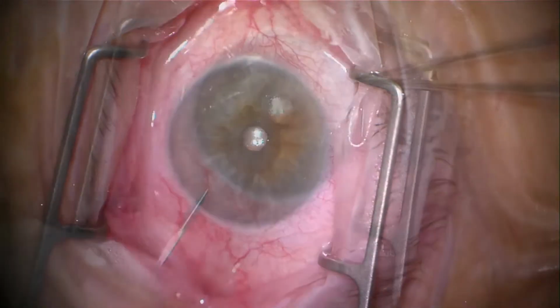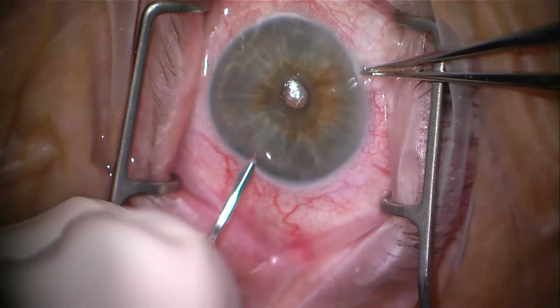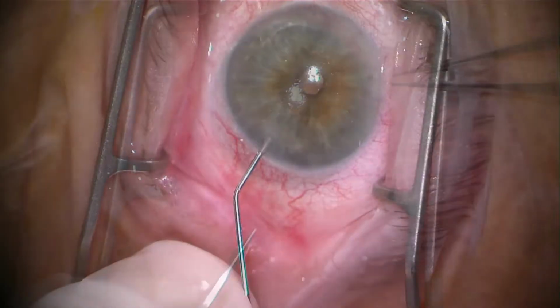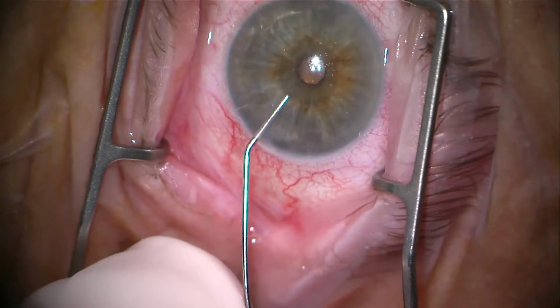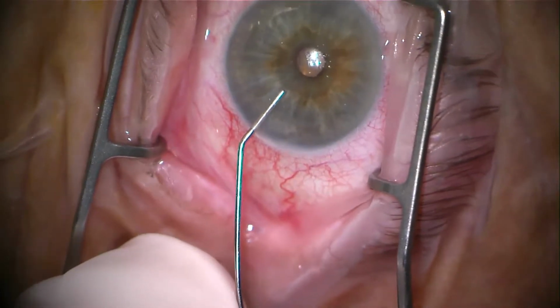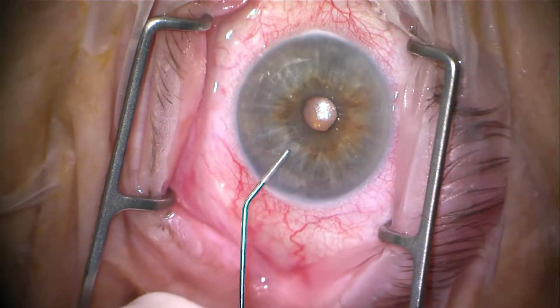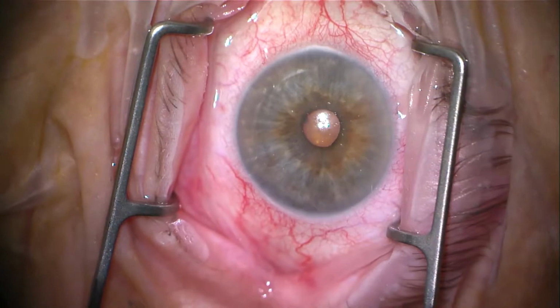All right, so in this patient, they haven't received any medications yet. They've got a significant benzalkonium chloride allergy, and I've only given them, until this point, Vigamox and the betadine prep. This cannula is the first intracameral agent being used, and it's MPF-Lidocaine only.